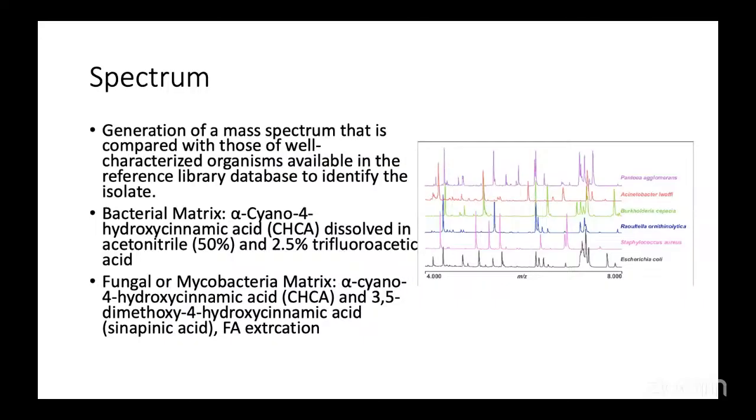Now, what are the companies which are available? One is BioMérieux's Vitek MS and the other is Bruker. There is not much difference between the two. Some give you filamentous fungi, some give you only bacteria, some give you bacteria plus yeast only. So this is all you require.